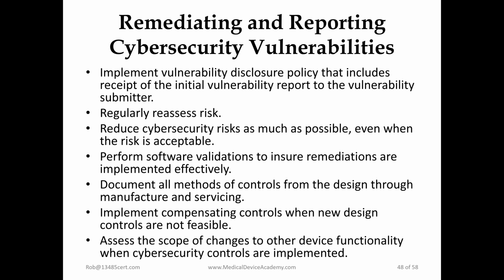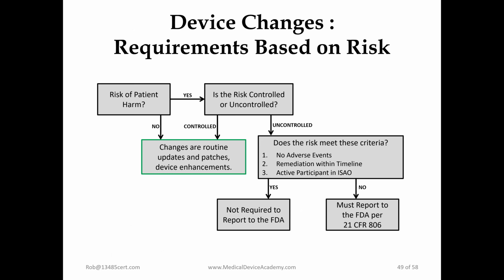And then the FDA requires you to remediate and potentially report cybersecurity vulnerabilities. These are some examples of how you need to be remediating them and documenting these. If we go to the next slide, this is the flow chart for when you maybe need to report these vulnerability exploitations to the FDA.